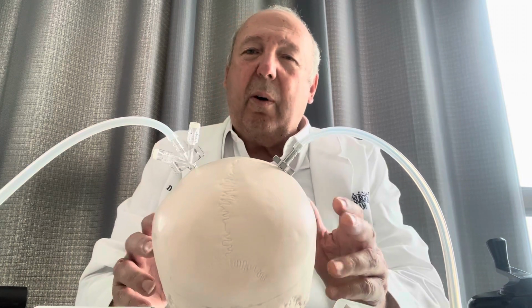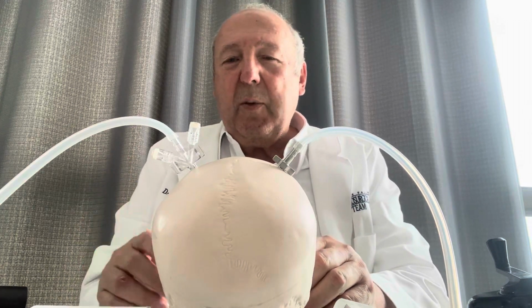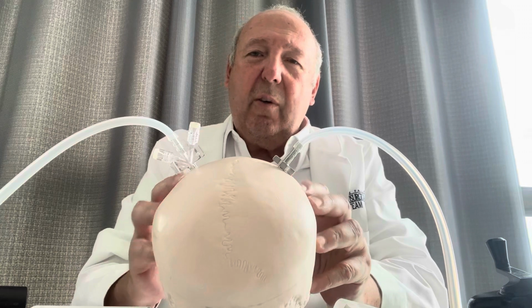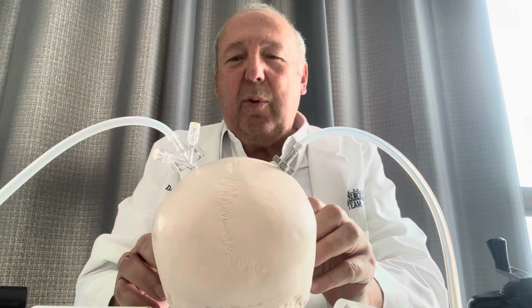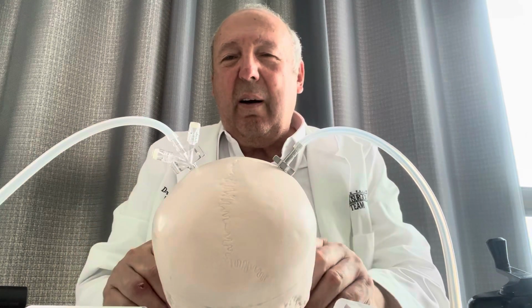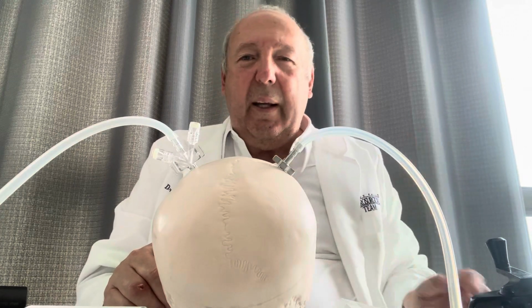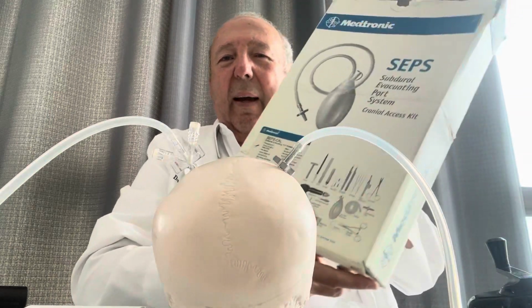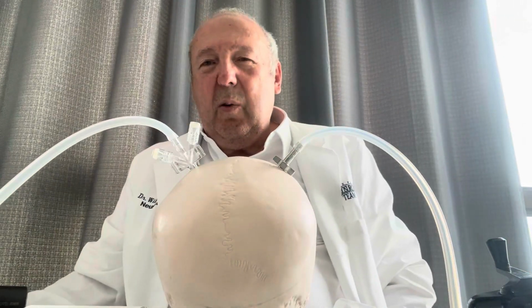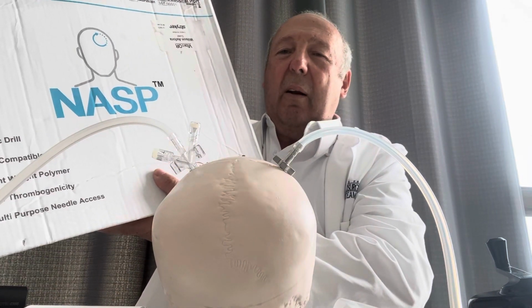They're both effective, portable, simple, fast, can be performed in the patient's room or anywhere in the hospital, and they exert a negative pressure homogeneously throughout the subdural space, promoting evacuation of the subdural collection and expansion of the brain. The SEPS has been around for over 20 years, is distributed by Medtronic, while the NASP is a newer device distributed by Axial Health LLC.